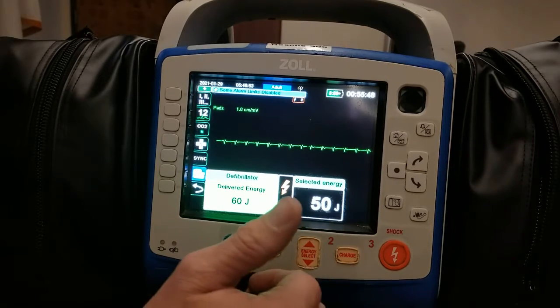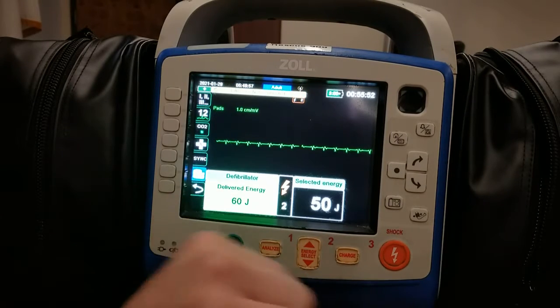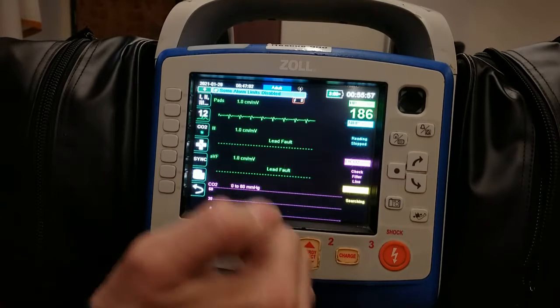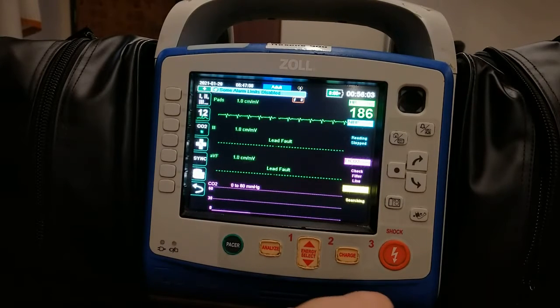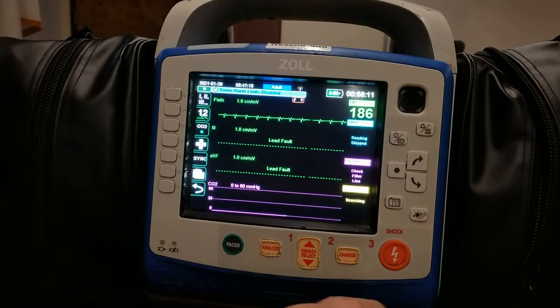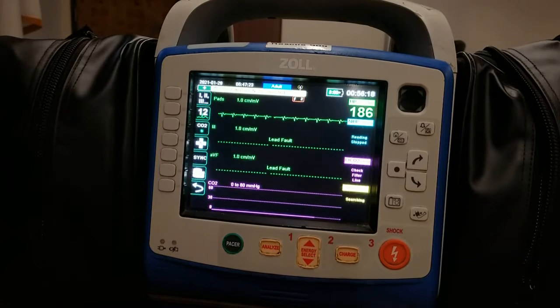Now, if our scenario was set up right, we could expect to see the patient momentarily flatline, hopefully come back into a sinus rhythm that's at a more acceptable rate. If we do not get that response, that's when we prepare to synchronize cardiovert again at a higher rate. Now, with synchronized cardioversion, you can consider sedation of the patient. It's going to depend on how unstable they are. If your crew can help you get out the Versed and we can sedate this patient, great. If they're losing consciousness, let's not worry about that. Let's move right to the synchronized cardioversion.